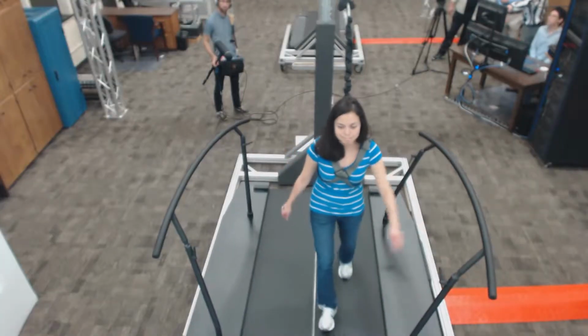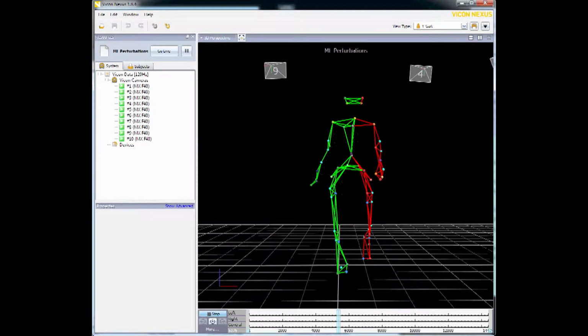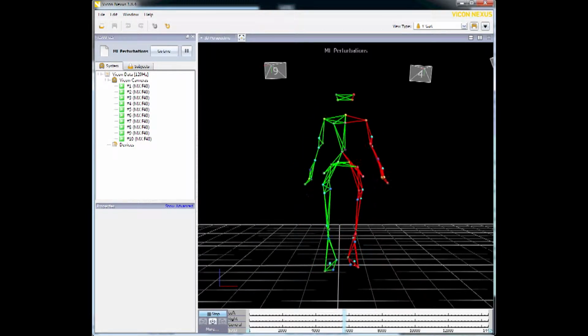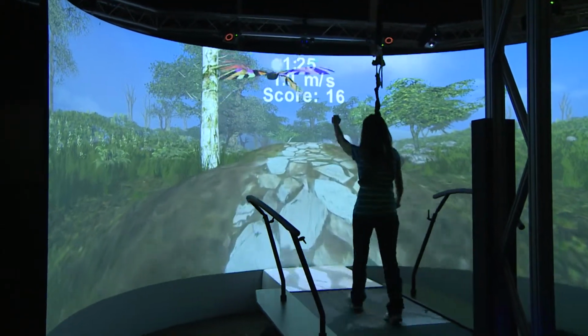So the equipment can be used as a diagnostic tool. By providing different combinations of perturbations, we should be able to determine whether or not a person's impairment is primarily physical or biomechanical. Is it a strength issue? Or is it sensory, they're just not sensing the perturbations? Or is it more of a cognitive issue? Ultimately, we'd like to take the specific things that we learn from this system and build that into a take-home system that would be a small treadmill with a Wii and a television, and the therapist and the clinician can monitor everything that the patient is doing at home.